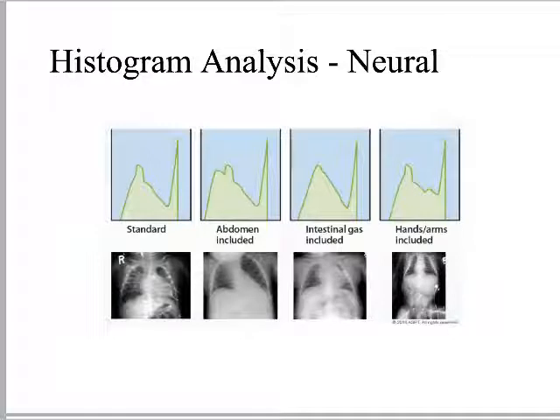So it's this part here. And this is just restating something I've been saying the whole time. When the radiographer is at the control console selecting the procedure algorithm, so when I tell it chest x-ray, right? This assigns a type of histogram analysis to be used based on the shape the acquired histogram will be expected to have.